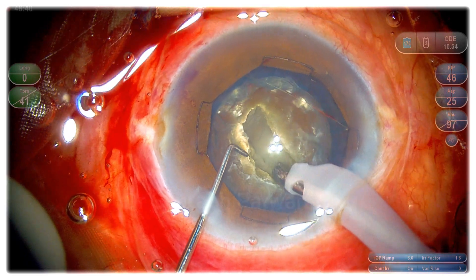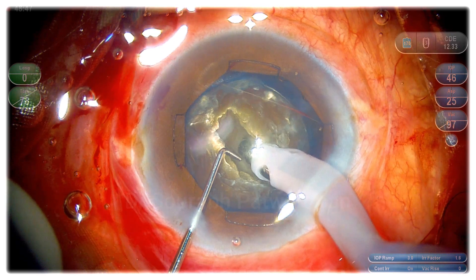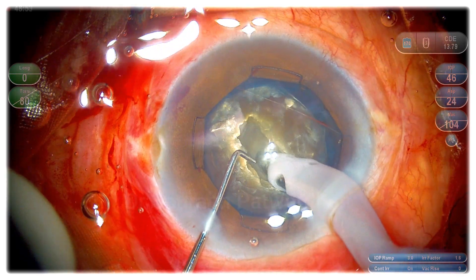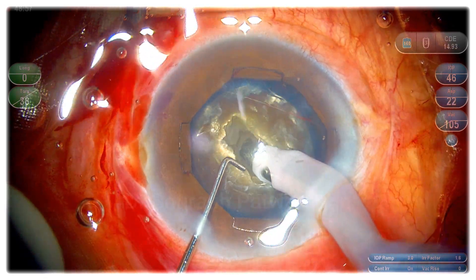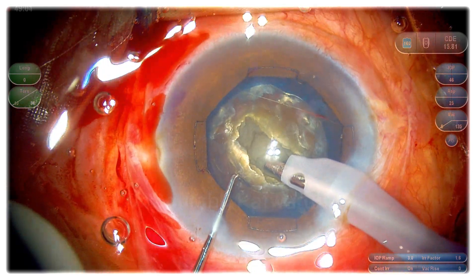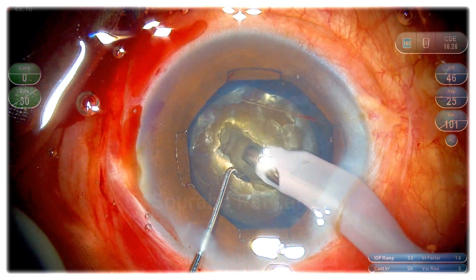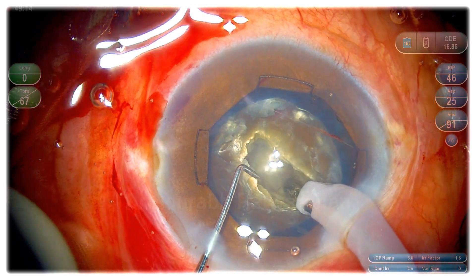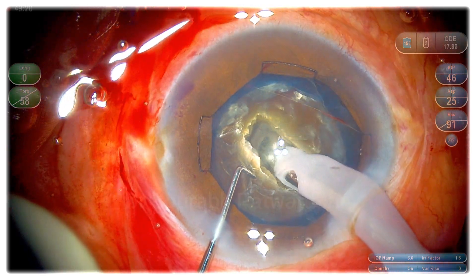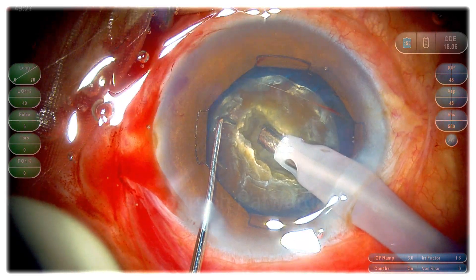I am widening the trench a little bit so I can dig deeper — keep on digging deeper in this case. Believe me, it is very difficult to punch a hole in these cases; if you still manage to punch a hole, do send me a video. Patience is very important here; I should not go and try to divide prematurely. This is a case which I demonstrated to my delegates who attended Fekotips 5.0, so I am also speaking while operating.